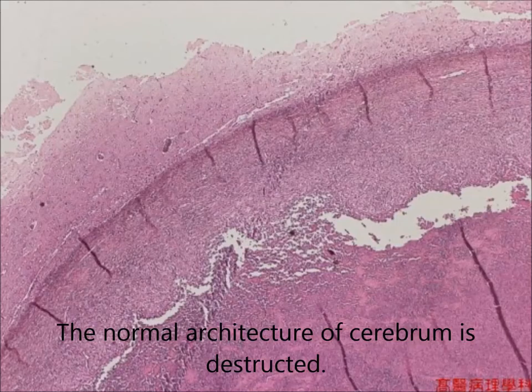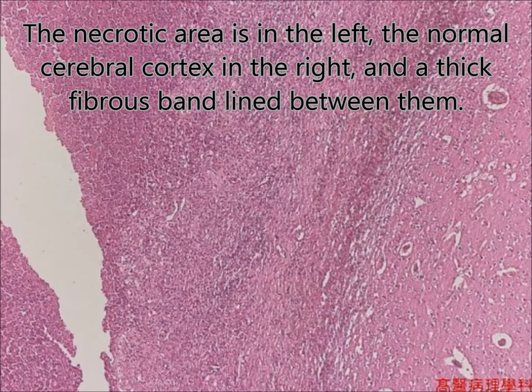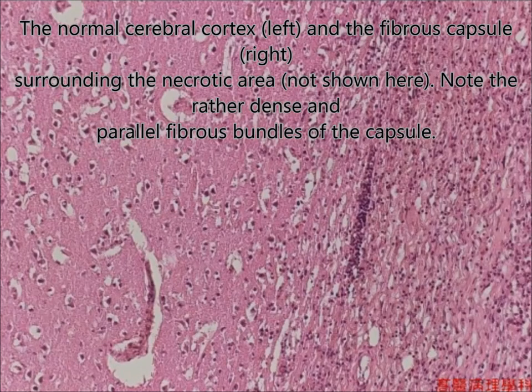The microscopy of the brain shows loss of normal architecture and destruction due to neutrophilic infiltrate. The necrotic area is on the left side and the cerebral cortex on the right side, with a thick fibrous band lining between them, due to the infection. Older sections show peripheral fibrosis.